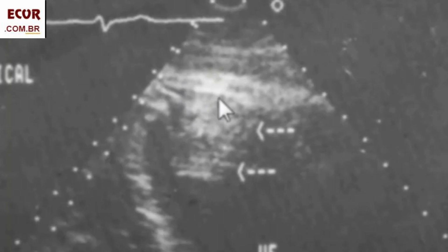First, because we see that the width of the reverberation is about the same as seen in these brighter regions that we see outside of the cardiac image. Look here. These are the brighter regions. They are the layers that will reverberate. Notice now that the width here of the possible thrombus is about the same.